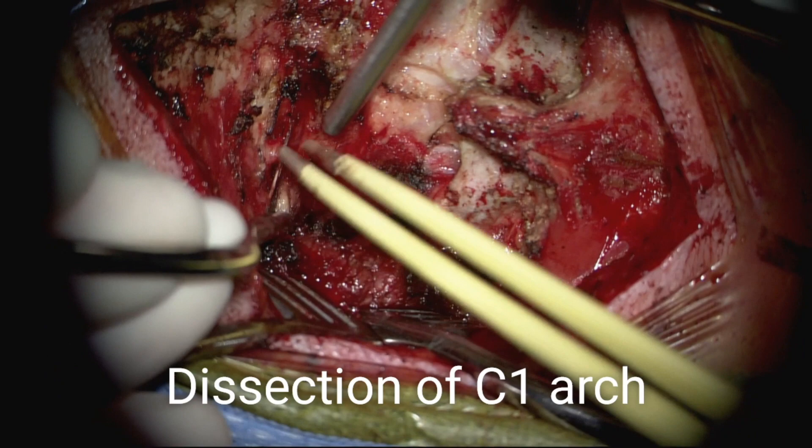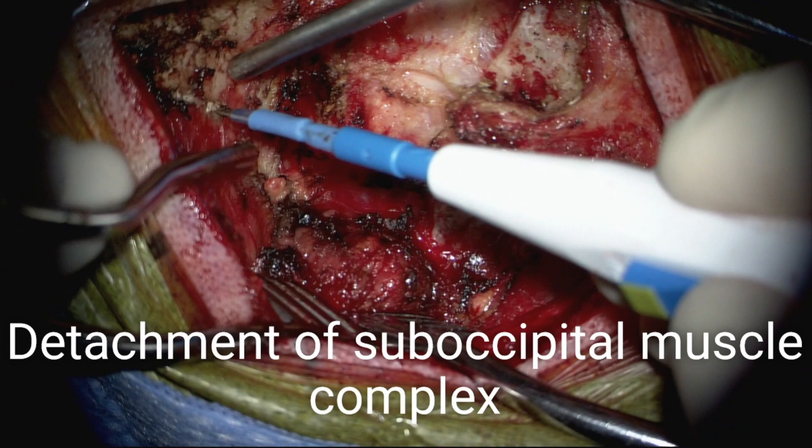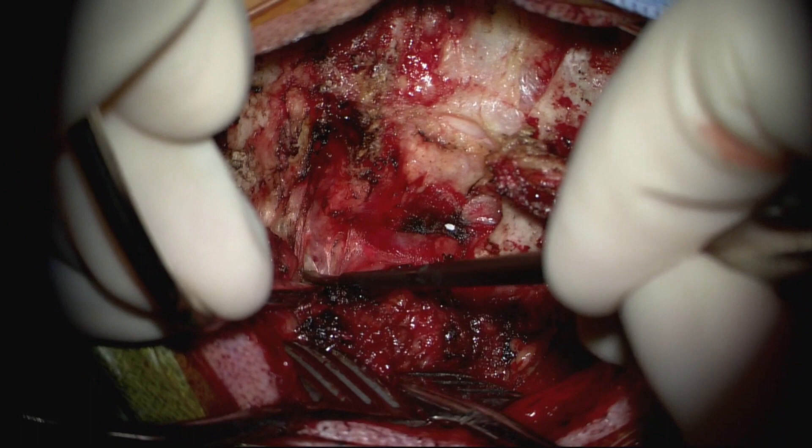After the initial midline exposure, the C1 arch is dissected laterally by a combination of blunt dissection and electrocautery. Medial aspects of the suboccipital musculature, such as the superior oblique muscle, may be dissected in order to provide a wider exposure. The superior margin of the C1 arch is identified and the transverse process of C1 is then defined.